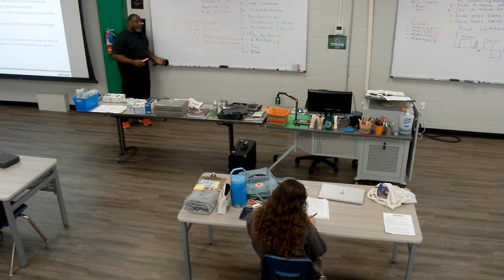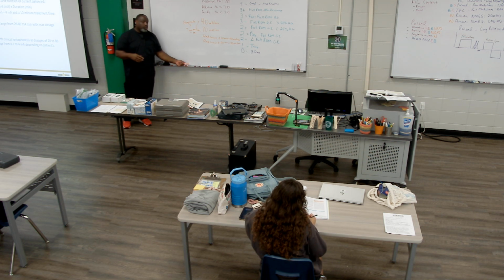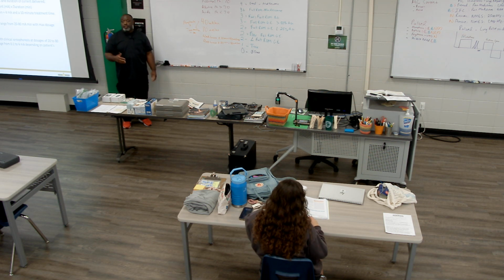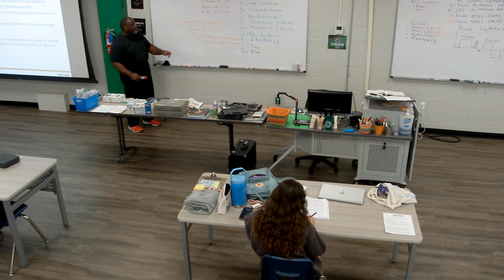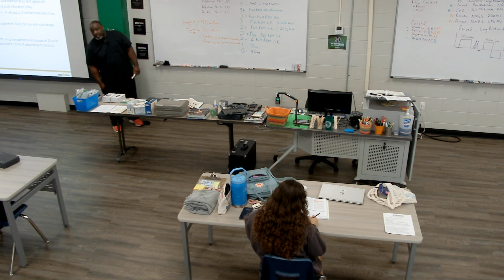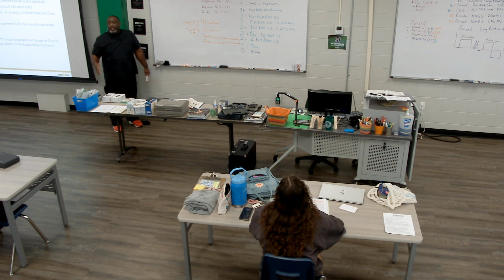Now your patient may not be able to tolerate 4 milliamps of current, so you may have to adjust your amplitude to their tolerance. But as amplitude goes down, time will automatically go up. Let's say the PT has requested a 40 milliamp minute dosage of iontophoresis over the biceps tendon because of biceps tendonitis.